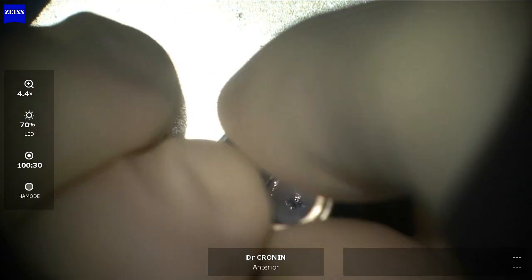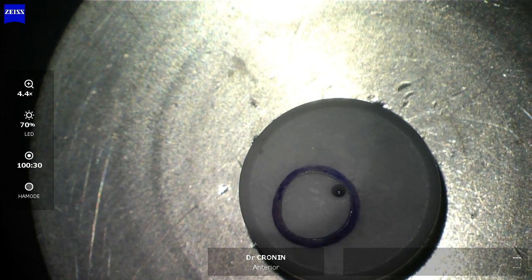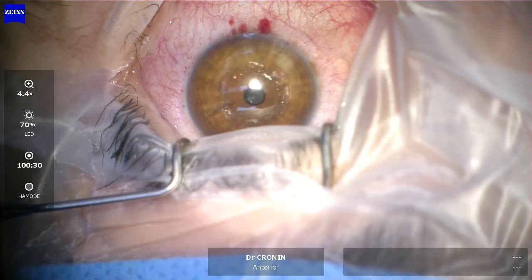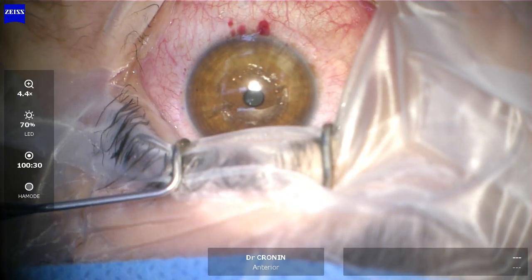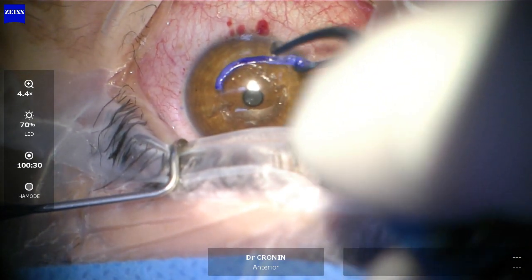Next, we prepare the donor tissue. Normally I do this with the laser, but I'm using a special curved blade called a trefine to highlight it here. I've cut that little rim of donor cornea and I dissect it into just the right size that I need to insert into that tunnel created by the femtosecond laser. Now I'm going to put that little rim of tissue into the special tunnel created in your cornea by the femtosecond laser.